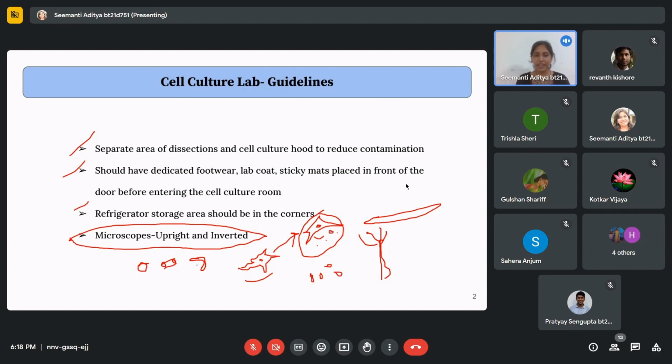If it is a bacterium, it will either move front and back, or it will show a vibration kind of movement. But if it is a particle, it's not going to move. Like with your cell culture dish, if you are moving the dish, the media is there in your dish, and with that media the particles will show movement. Suppose you put sand in water in a bottle, then if you move the bottle, you will see the particles moving. Otherwise it is mostly at rest, or maybe some little movement, not like the movement of spiral bacteria.